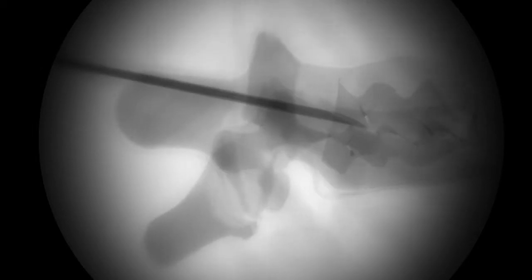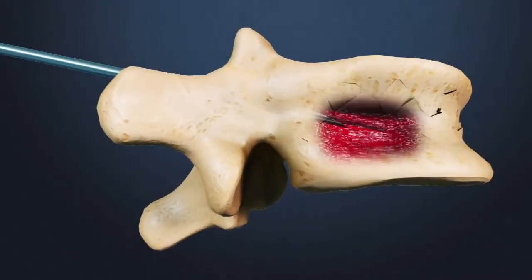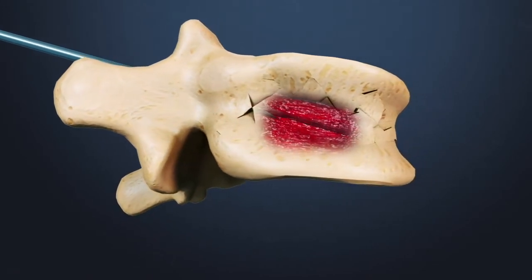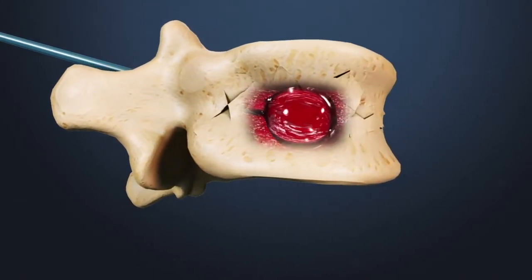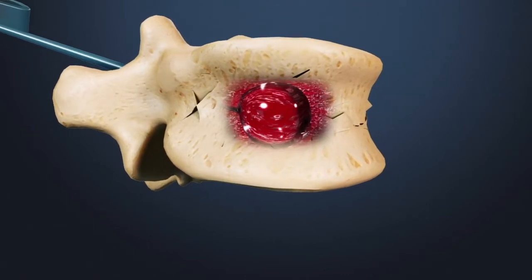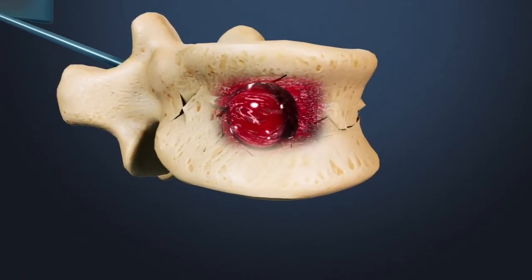In balloon kyphoplasty, a balloon tamp is then inserted through the tube and into the fractured vertebra. Once inside the vertebra, the balloon tamp is inflated to create an open cavity inside the bone and to restore height to the collapsed vertebra.